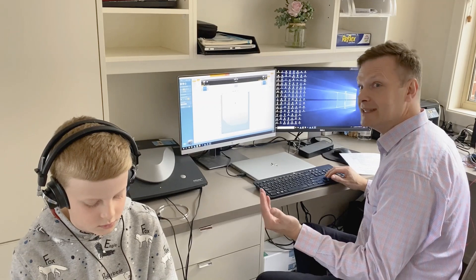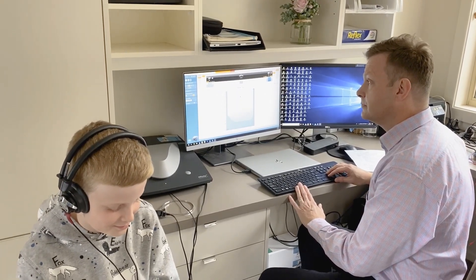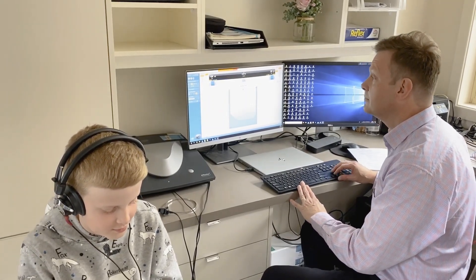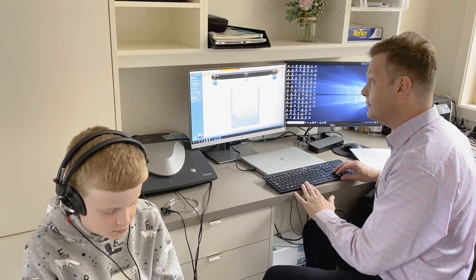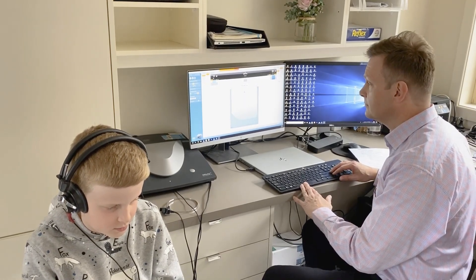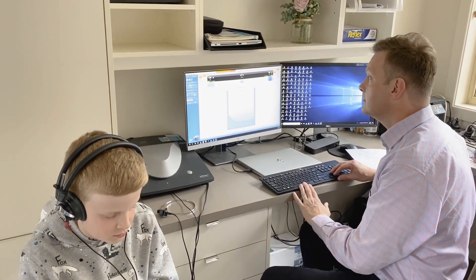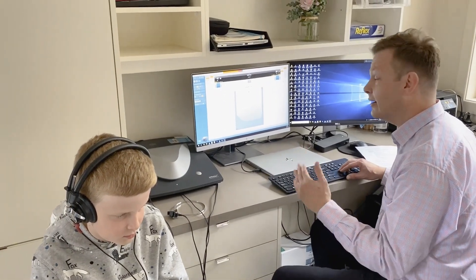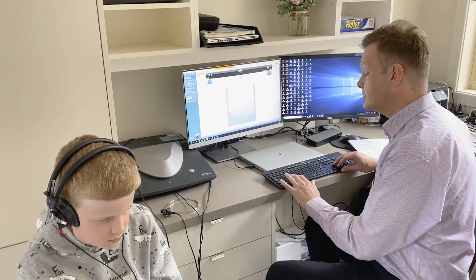He's responded at 30, so I'm going to go down by 10. He's heard it again. He's heard it at 10, and now I'm going to go down to 0. He's heard that at 0, so we can go down to minus 10. No response — going up by 5. Still no response, going up by 5 again. He's heard it there — that's 1 on the ascent. Going down by 10 dB again. No response. He's heard it at minus 5. Going down to minus 10.